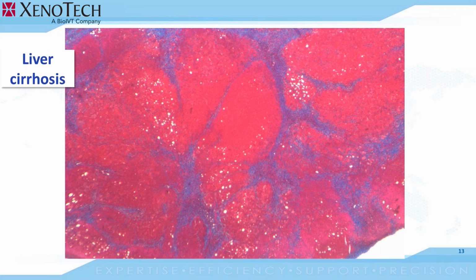in the body. And of course, the slide has been stained for collagen fibers with Masson's trichrome. You see thick bands of connecting tissue that distorted normal architecture of the liver and therefore the organ's function. The fibrosis score in this stage is 4. This is the highest that can be given. And we can disclose that heavy alcohol consumption led to these conditions.